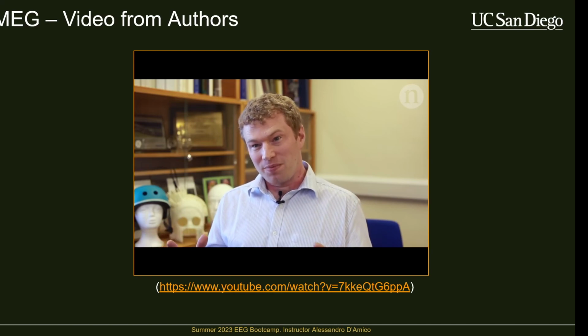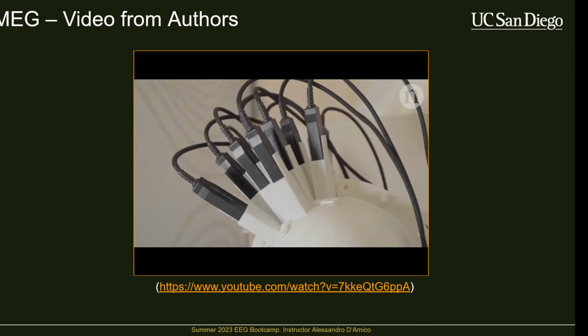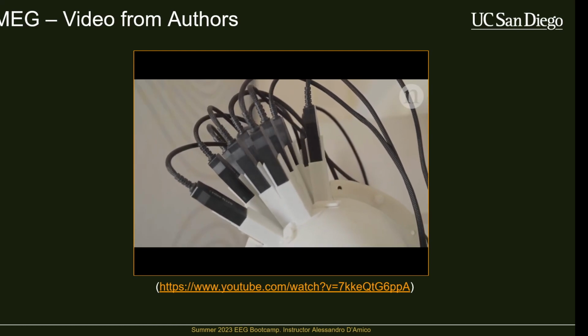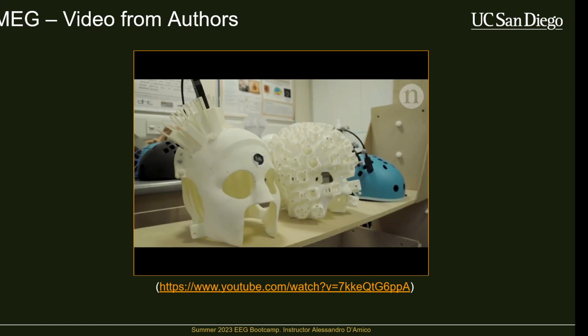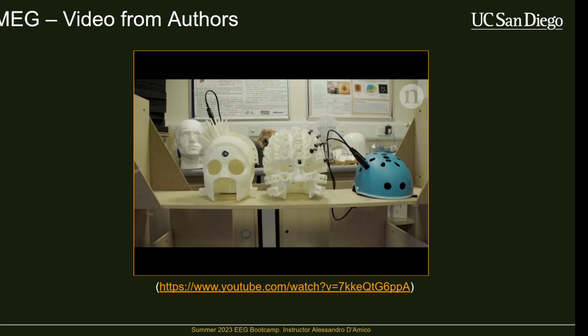So to build a reliable imaging system, you really need two things. You need very, very sensitive magnetic field sensors that are small, lightweight, and that can go on the head. That's what we have with the quantum sensors. And then you need a way to house them on the head. And so to do that, we built a 3D printed head clamp that would house the quantum sensors close to the skull, and it was designed based on a single subject head shape.